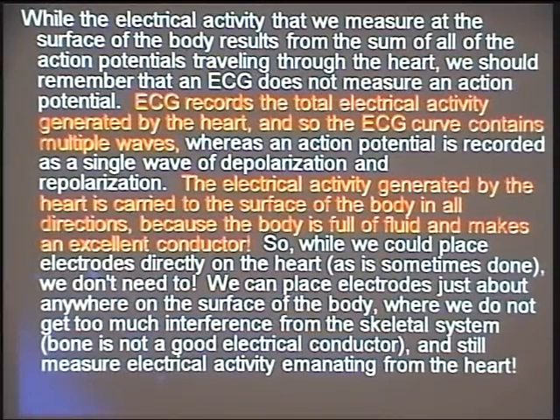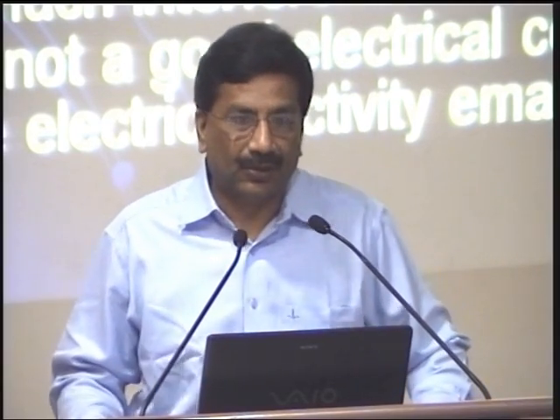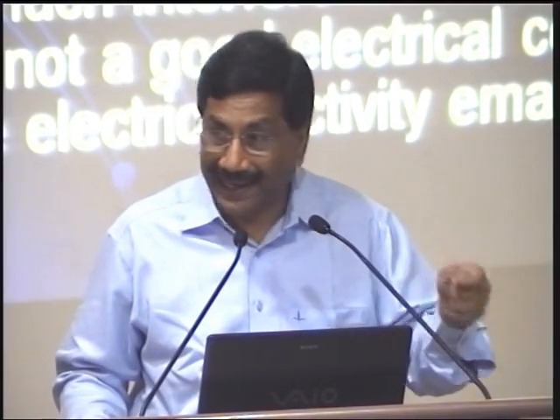As students we used to wonder: the heart is in the chest, so why tie down an electrode on the legs? Your organ is not in the leg. For no other organ do you do that. You do not put a transducer on the leg to look at the liver. Only for the heart, which is here, you are tying down the electrode on the legs.